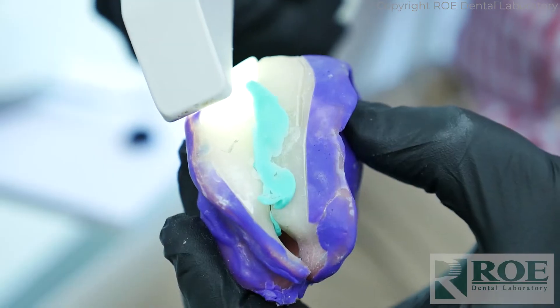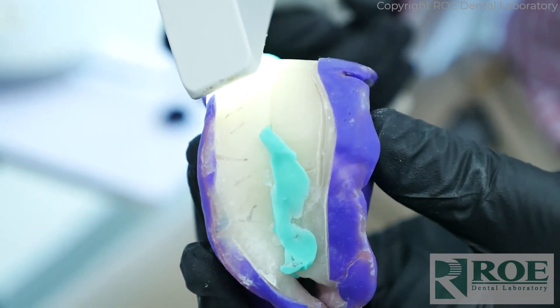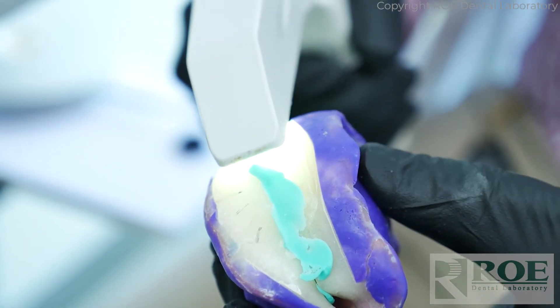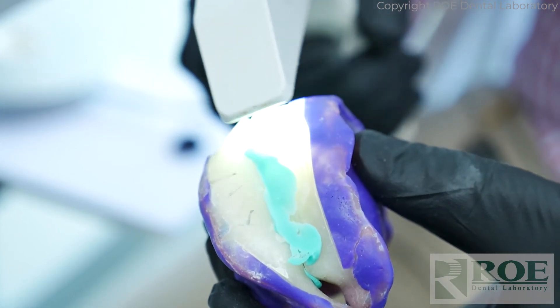The same thing applies to the lower — scan them both independently, then use the bite registration to hold them together, and simply scan the bite. Scanning white can sometimes be a little challenging, but just keep scanning as much area as you can. Even if it doesn't fully register on our end, we can put the upper and lower together. From that, we'll send you a final denture.